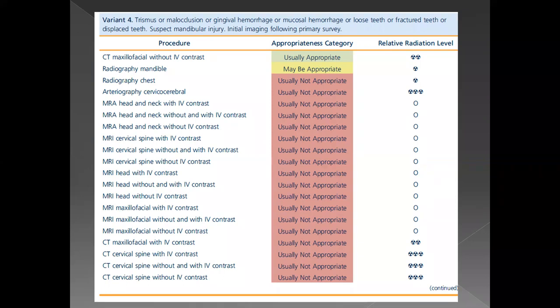So wherever it is possible, and if you guys are part of the ER or you're working in the ER, wherever you are training or currently working, do try to tell your radiologist that if you're evaluating the cranium in emergency anyway, just bring it down all the way to the mandible or to the thoracic inlet, so you can evaluate the cervical spine and the whole of the face, so the patient does not have to go through extra radiation. It will hardly take them more than a few extra minutes to evaluate all this extra region. And you can get a lot more information which you would not be able to get with plain radiography of the mandible.